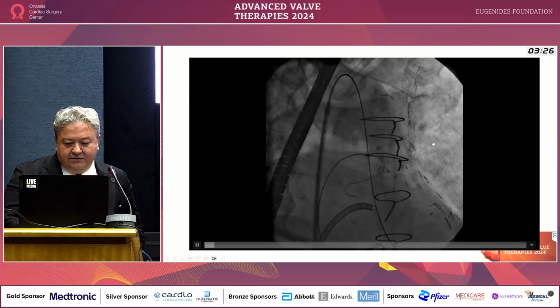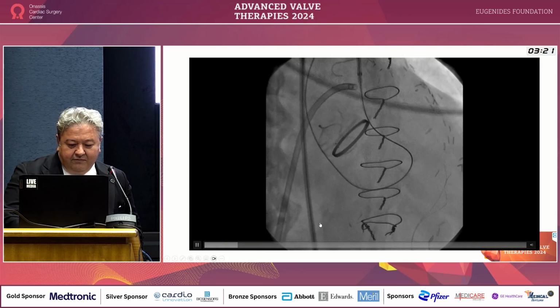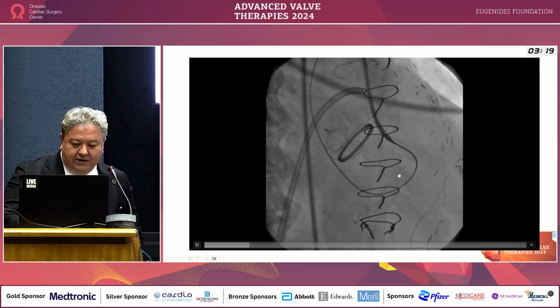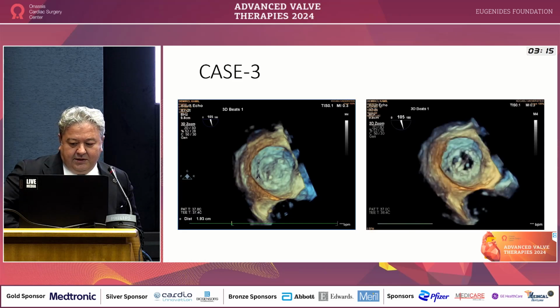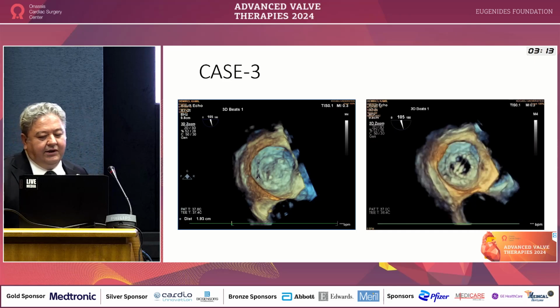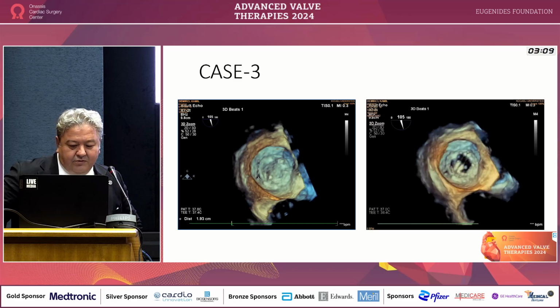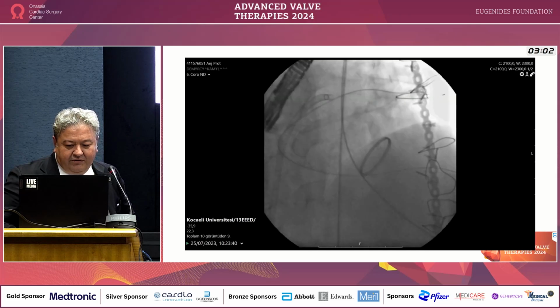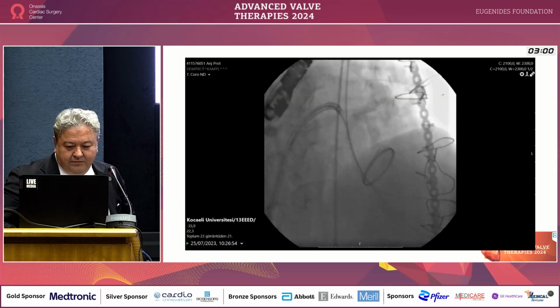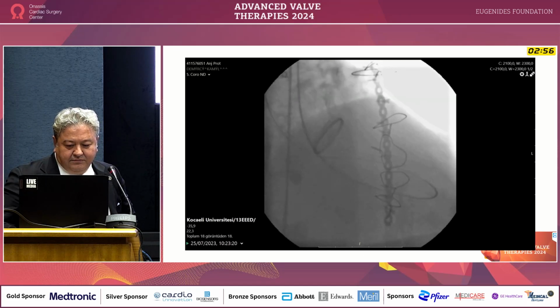The second leak was recrossed by the Terumo guide wire, and we used the long Occlutech delivery sheath. And this is a very interesting case also. You can see the large medial paravalvular leak. We crossed the leak again by a retrograde approach and made our wire loop again.